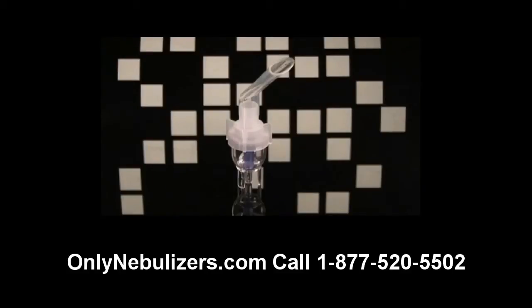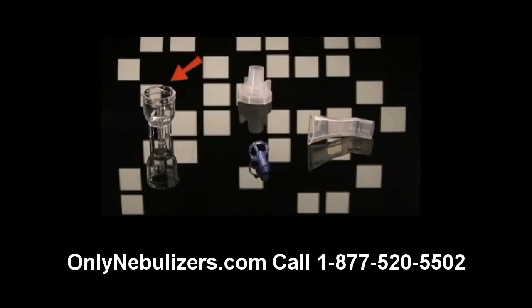Your nebulizer consists of a mouthpiece, medication cup, nebulizer cap, baffle, and tubing.